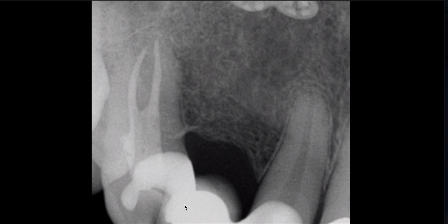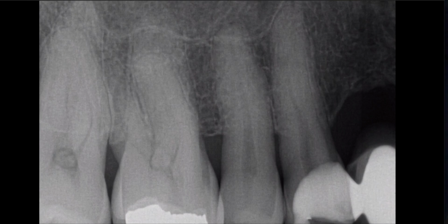In the preoperative radiograph, what's really interesting is I thought there might have been 3 canals or a rotated tooth. If we take a look here, this is tooth number 14, and we've got, it's very subjective, 20 to 30% bone loss. What I've been trained is to look for the reason why this tooth became necrotic, because the diagnosis of this tooth is necrotic with normal apical tissues.